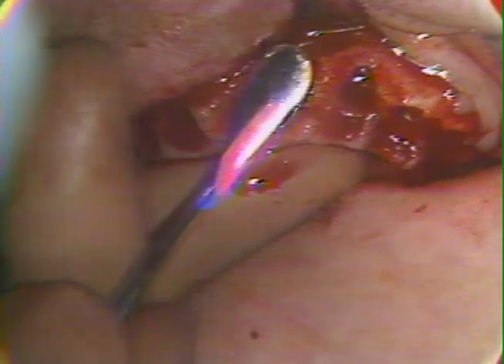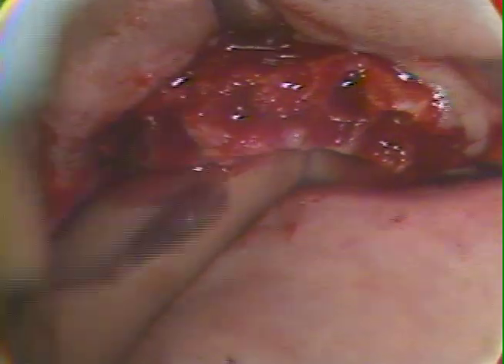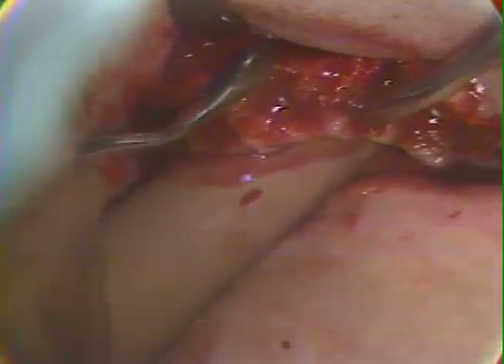Here is the application of the bone file, cutting on the draw stroke. That's the only way that it is effective. And using a rest finger, so we have things well under control. And I'll be reflecting this palatal flap at least enough to get over the alveolar crest once again. And I have to trim those soft tissues out sharply.